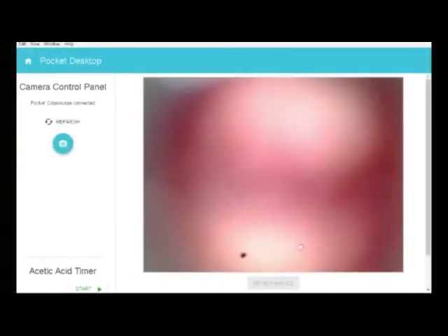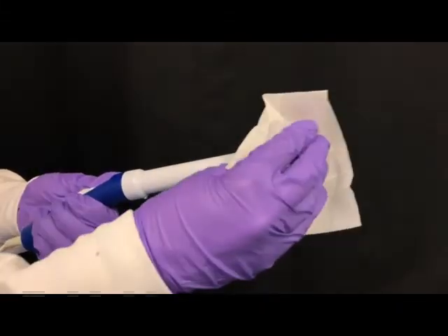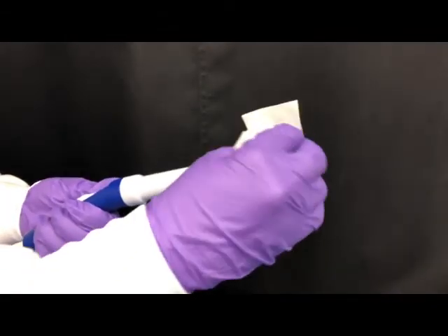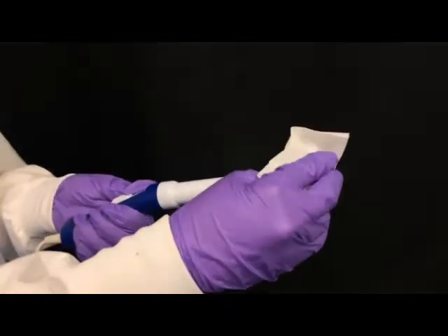In the event that the probe tip contacts tissue or the image appears hazy, remove the probe and gently wipe the tip clean with a sterile cloth or swab. If cleaning the probe tip does not improve the image quality, contact Hadley Health Technologies.